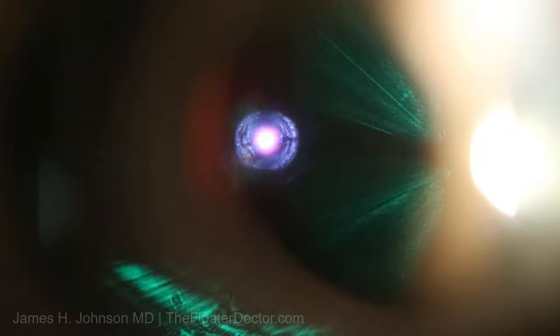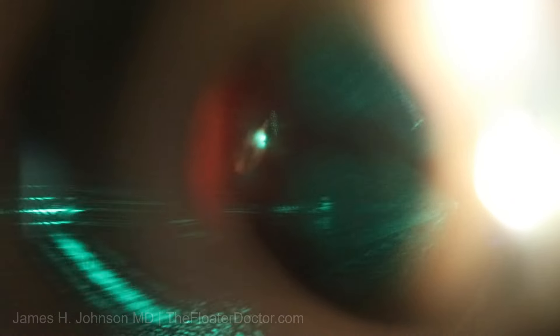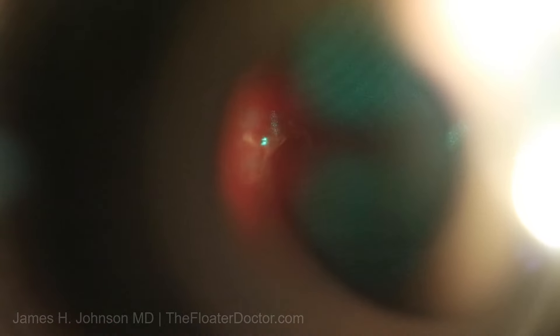I can say this is what I like to treat — these have the highest expectation for satisfaction and are the most efficient to treat. And by the way, this Weiss ring is a one-time floater — you don't get more of them. The PVD, the membrane that peels away and drags this off with it, is by definition a one-time event. So you don't get more of them.